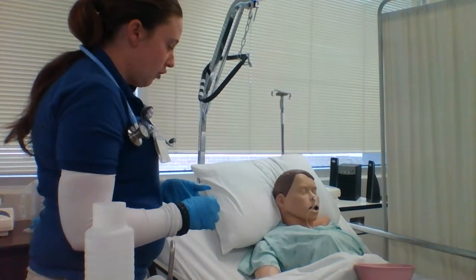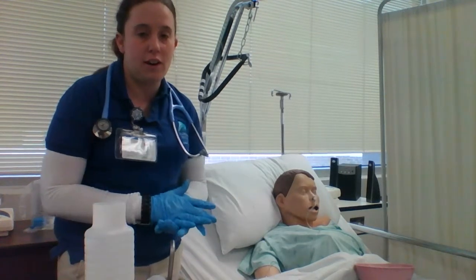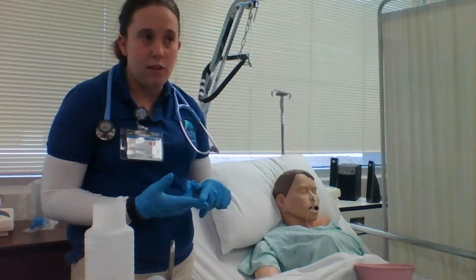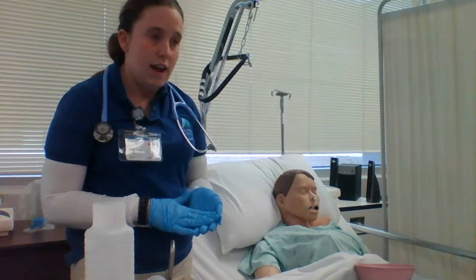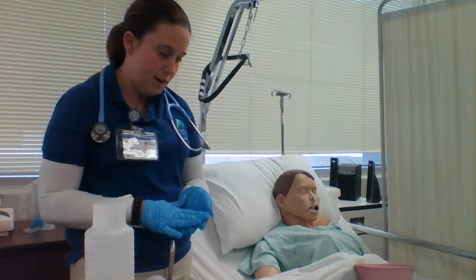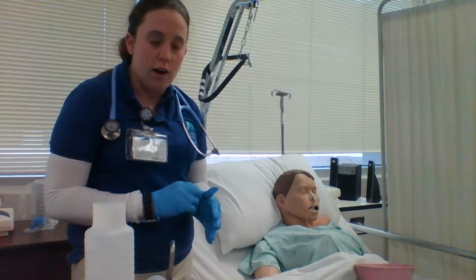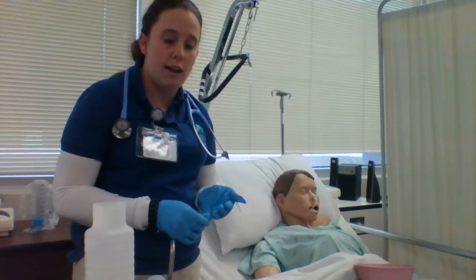And then I would do my documentation. The things that I would document would be the time, the date, the type of tubing, the length of the insertion. I would also document any of the drainage, what the consistency and color was, as well as the pH level, which was a 4, which is good. And I would also document the intake and output of any of the drainage and how the patient tolerated it, as well as any client teaching.